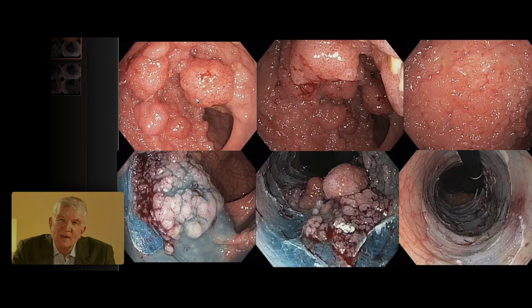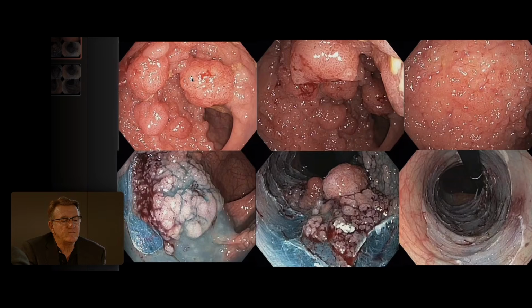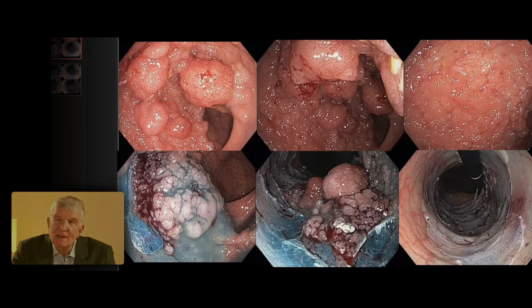But from the very first case in this episode, you showed us you would have to do a close look onto the nodule. Yeah, we have. Well, that's assumed. Or nodules. We have to evaluate all of this very carefully. We don't see any disruption. These aren't big nodules. Maybe the biggest is 10 to 15. So I think there's no surface expression of anything concerning. So I think you can take this dominant nodule in one piece, this one in one piece, and remove the rest by EMR.